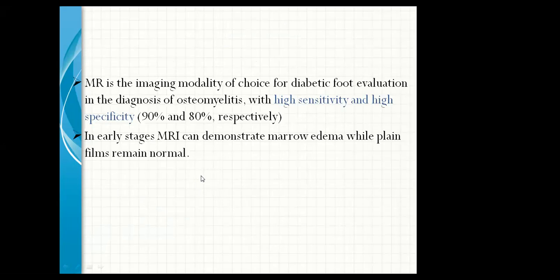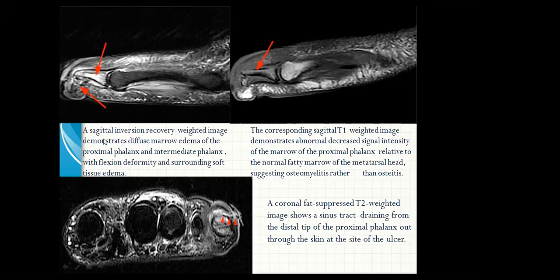In early stage, MRI can demonstrate marrow edema while a plain film remains normal. A sagittal inversion recovery-weighted image demonstrates diffuse marrow edema of the proximal phalanx and intermediate phalanx with a flexion deformity and surrounding soft tissue edema. The corresponding T1-weighted image demonstrates abnormal decreased signal intensity of the marrow of the proximal phalanx relative to the normal fatty marrow of the metatarsal head, suggesting osteomyelitis rather than reactive changes.